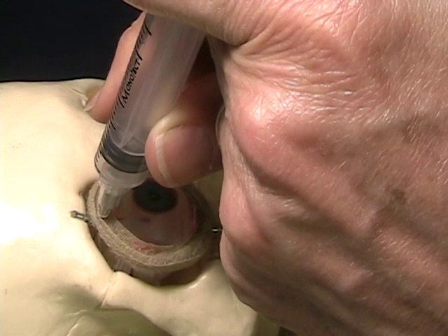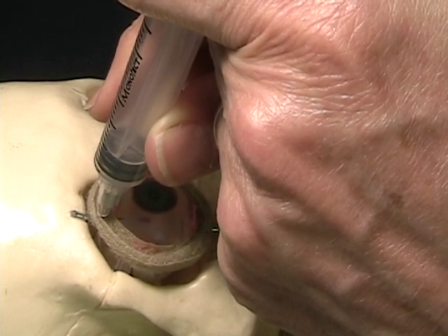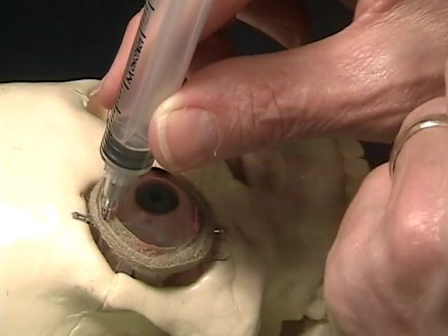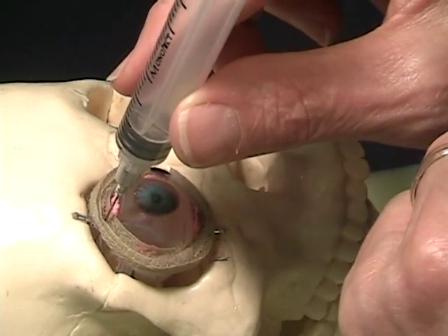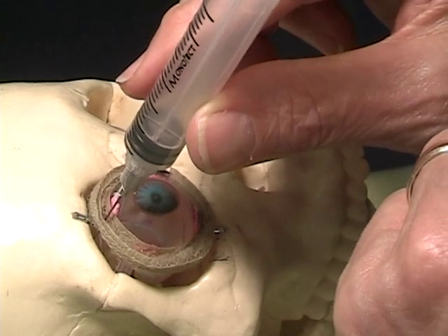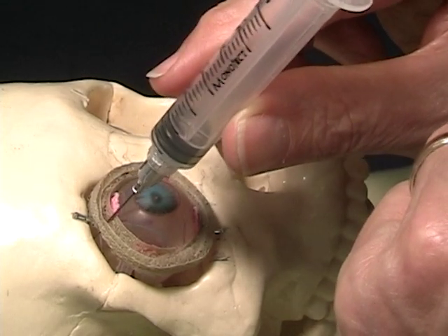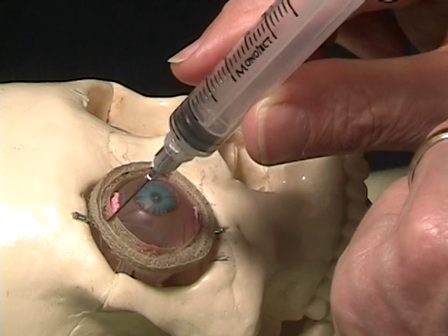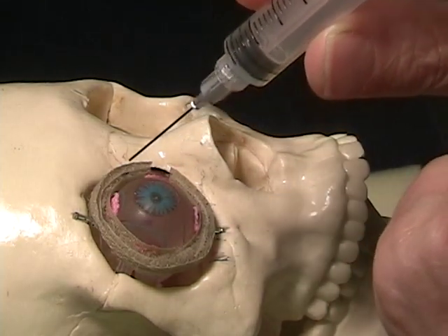As we complete this injection, we'll then begin to remove the syringe to about the half-inch mark. At that point, we invert the syringe to sit flat at about 45 degrees, and then withdraw it with the needle tip facing the superorbital rim and away from the globe.